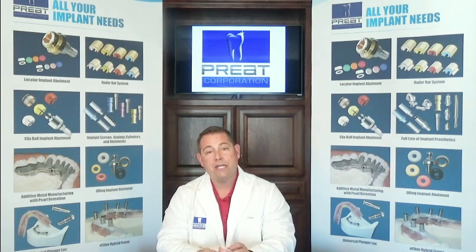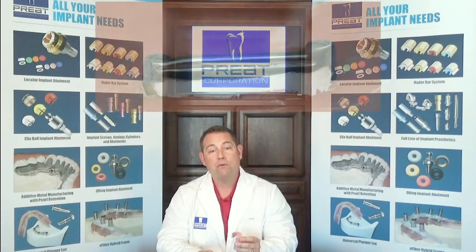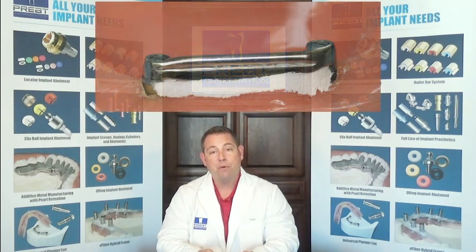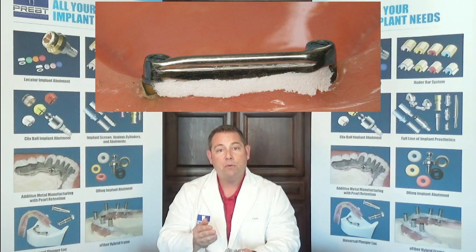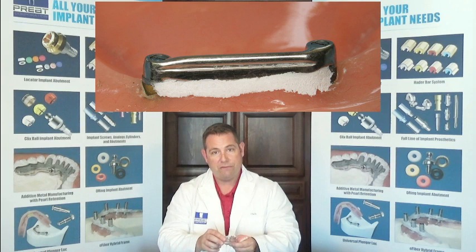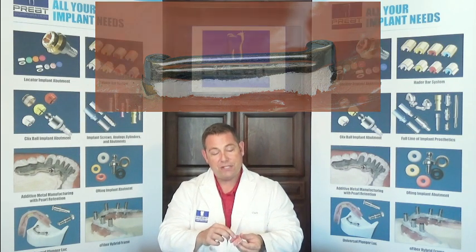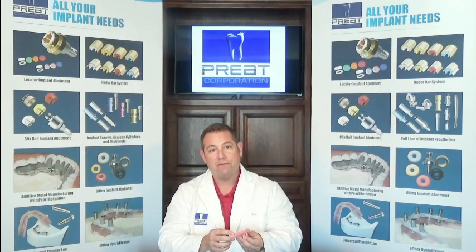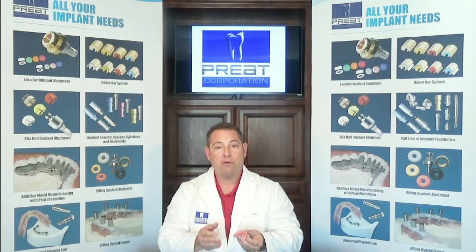When talking about relining a Hader bar overdenture, there are two simple steps we want to do before anything else. Number one, the undercut area between the bar and the gingiva we want to block out — we want to make sure there are no undercuts between the bar and the gingiva. Second, we want to scuff up the saddle or skirt portion of our prosthesis so that there's some mechanical retention for our impression material.